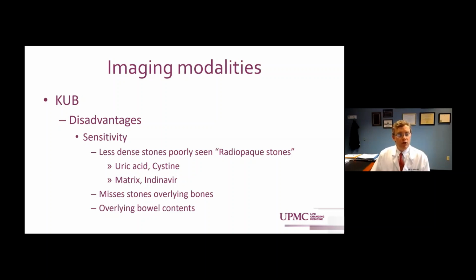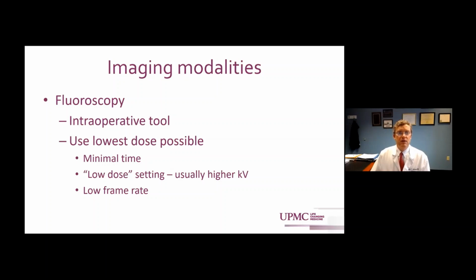So good test, but has its disadvantages. Fluoroscopy, an imaging modality we use all the time, really intraoperatively primarily. Just a couple tips that I wanted to throw in about using the lowest dose possible is obviously you only want to use a minimal amount of time. The person whose foot's on the button should be the one who's doing the actual whatever they're doing so that they can minimize that time.